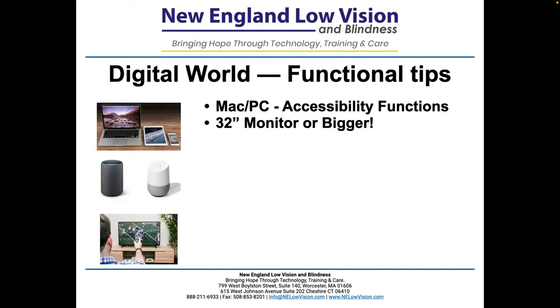Like, that's just way over the top. That would be too much, right? Two 43-inch monitors. So I'll at least try the one at some point. So I bought the one 43-inch just to see what it's like for Sam. And for someone like him who has central vision loss, he gets up really close to the monitor, probably about 2 or 3 inches away from the monitor, but he's able to see a lot of information on screen at one time.